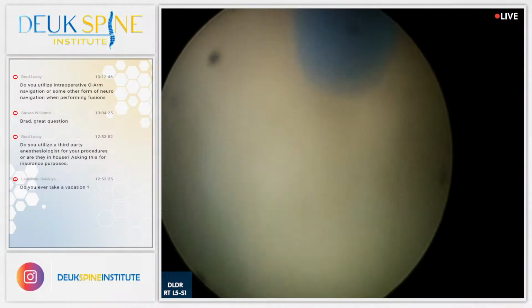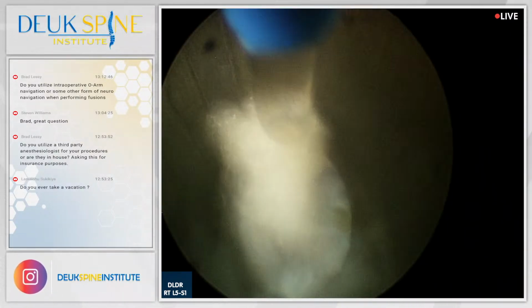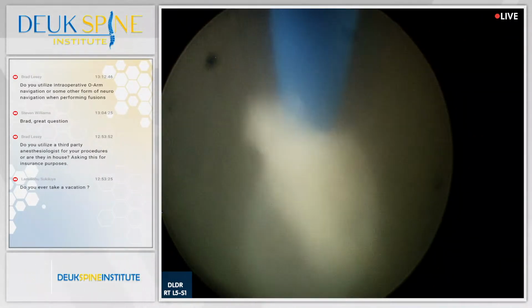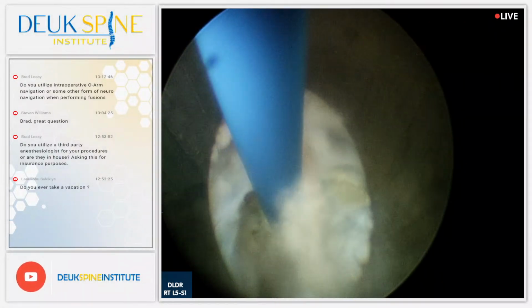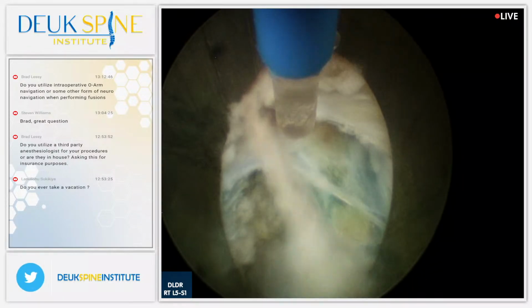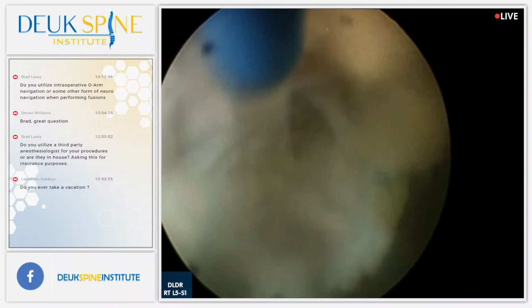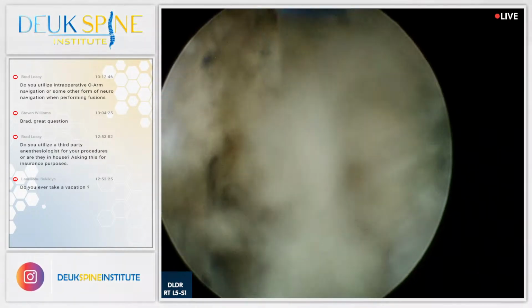All right. Yes. So, we do have two other questions coming from Brad on YouTube. Before we do that, I just want to show you. This is fat right here. All right? This is fat. And why is there fat? Because we have fat normally around the nerves, specifically the nerve roots. Fat protects them. All right, this is going to be the more painful part for him. I can see he's already reacting just a little bit. So, all right, let's take the question from Brad.